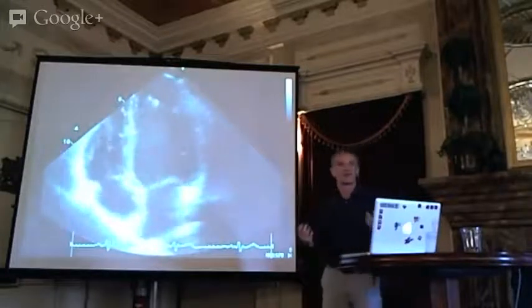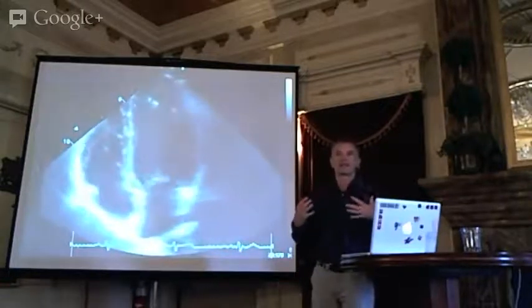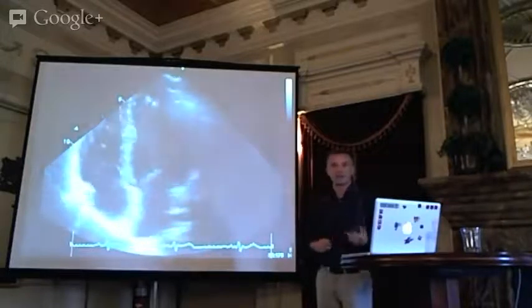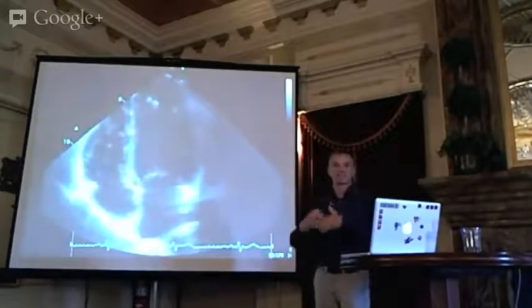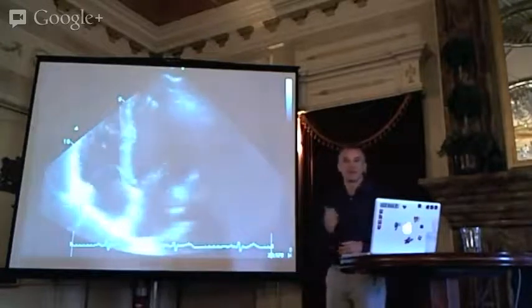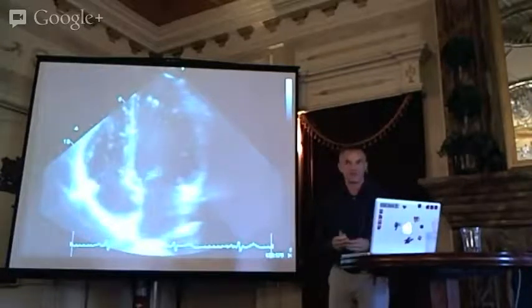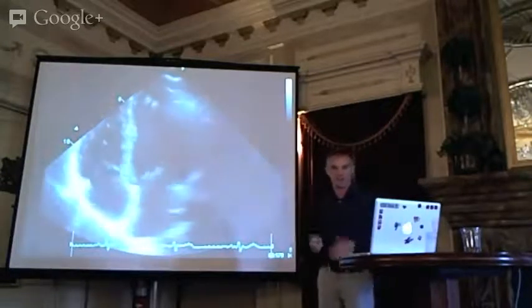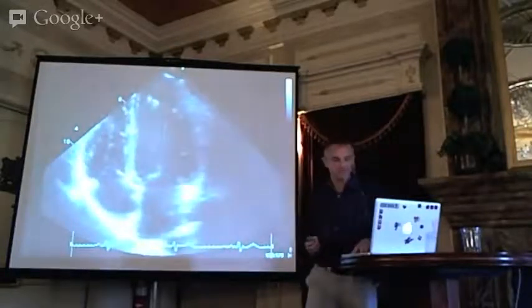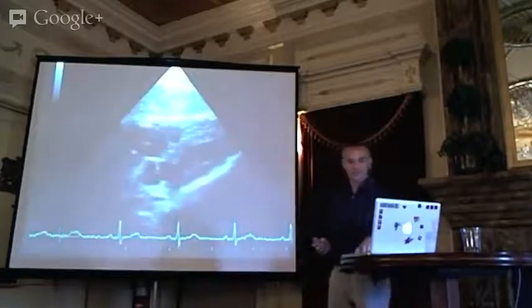There are patients who are on positive pressure ventilation or have emphysema, with a lot of expanded lung, where it can be difficult to get a transthoracic view, and you may be obliged to go transabdominally. Patients with big, tense abdomens, you might not be able to get the right angle to look up into the chest, and therefore you have to have a transthoracic option. It's very rare you have to do that, so I'm happy with the subcostal four chamber view that we're familiar with.